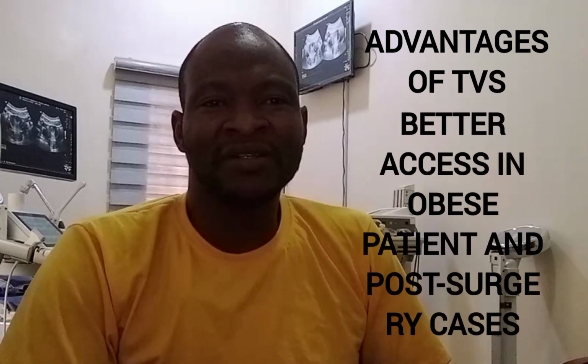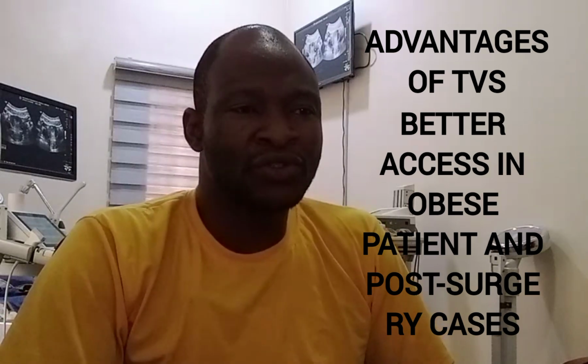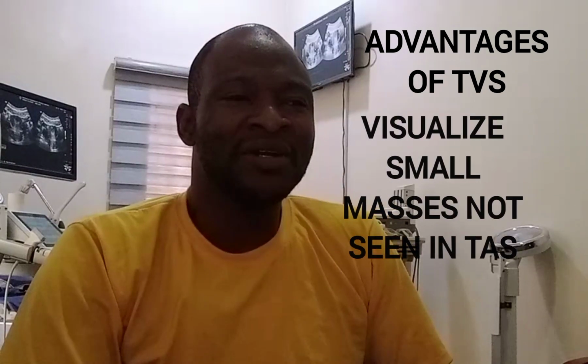It's good for obese patients and patients with abdominal scar from recent surgery. It's better for evaluation of retroverted and retroflexed uterus. TVS has better visualization of small uterine fibroids and small adnexal masses.